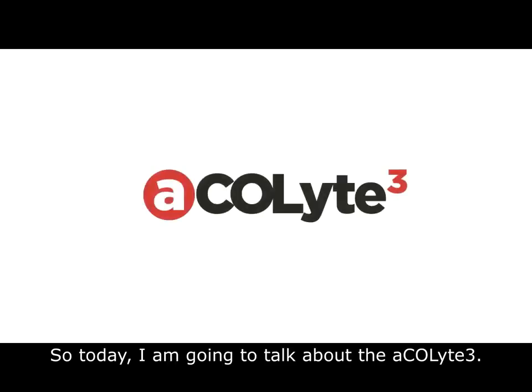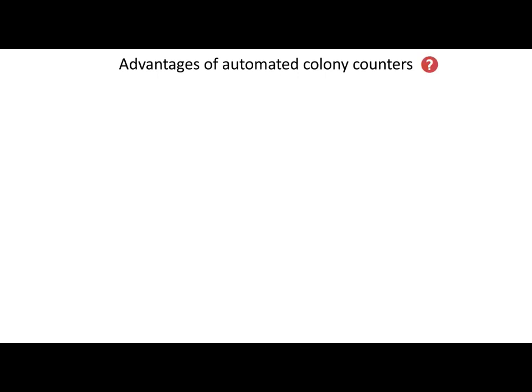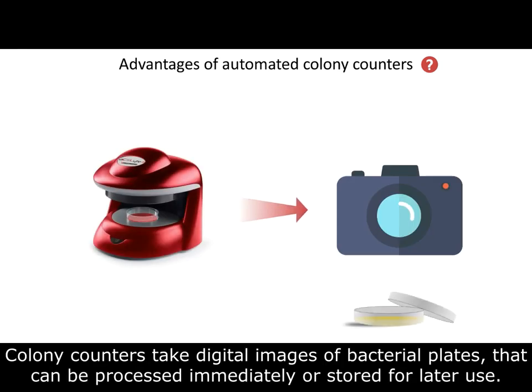So today I'm going to talk about the aCOLyte 3. But before I get into the details, I'll start by briefly outlining the advantages of automated colony counters. Colony counters take digital images of bacterial plates that can be processed immediately or stored for later use.